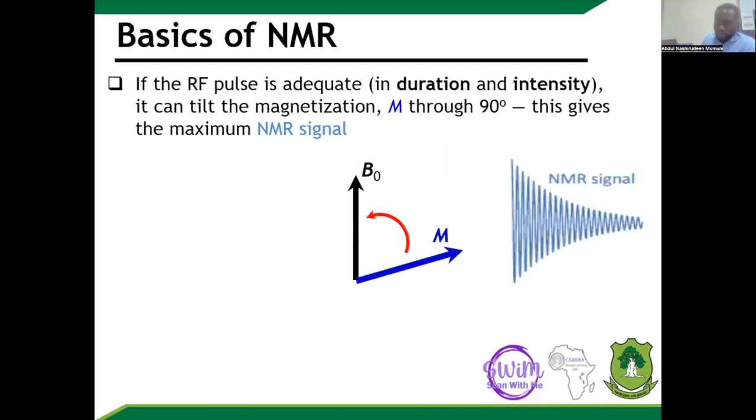Now we switch it back off. When it is switched off, they relax back to their original position. That process of relaxation is what leads to the release of the nuclear magnetic resonance signal. And that's what we then collect back using the radio frequency coil again. So it can send in and also receive the signal back, which is what we then Fourier transform. It's a mathematical procedure we do to convert the signals to the image. But it's not that straightforward. I'll mention gradients as well.